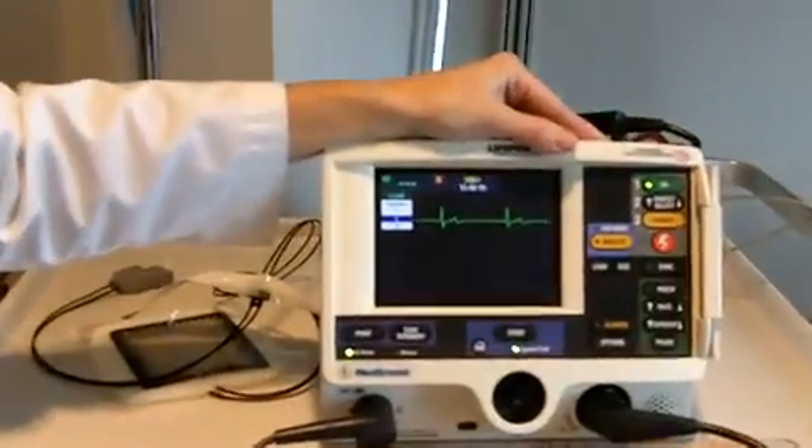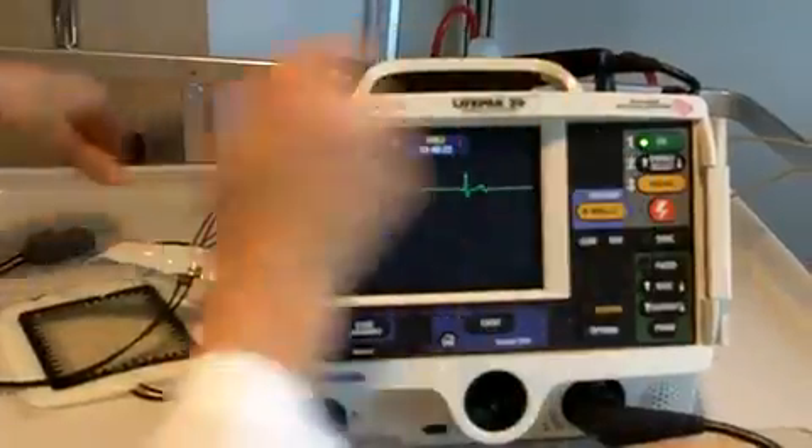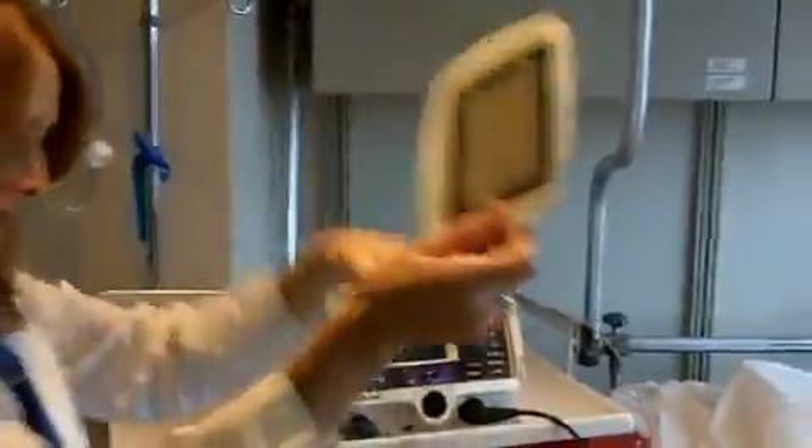Here my patient is in extreme bradycardia. I want to now apply my gel pads — my pacing pads — to my patient's chest. I'm going to use the anterior apex approach.